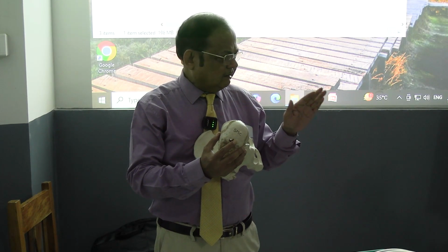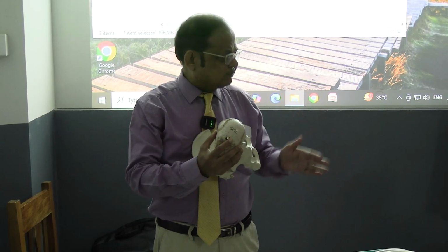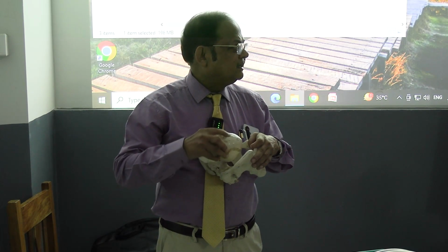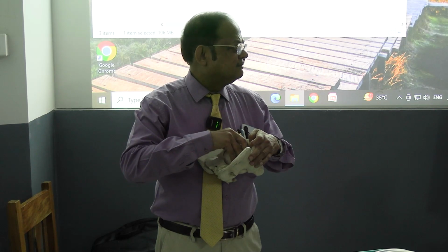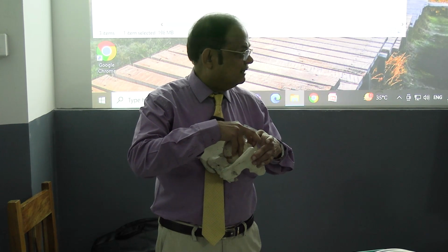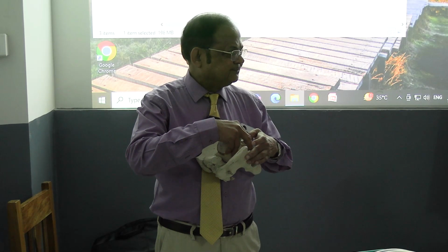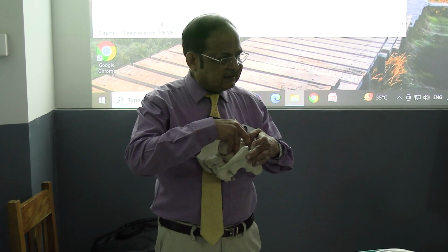You call it outlet forceps when the head is on the perineum. That is the outlet forceps: the head is on the perineum.